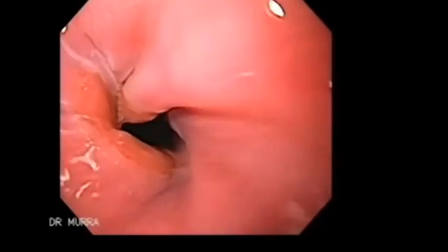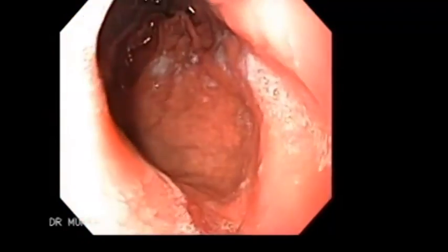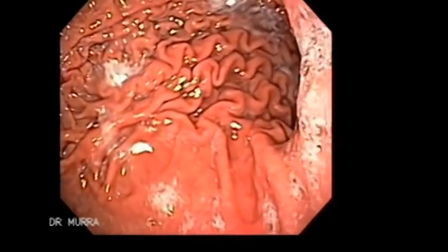This is the kind of image you would see on the video camera during an endoscopy. This is a digestive tract endoscopy. So the endoscope has been inserted down the mouth, down the oesophagus, into the stomach area and then into the digestive system.